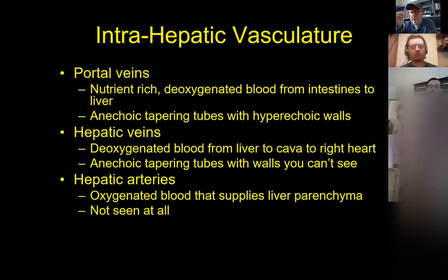Should I aspirate it anyway, just to make sure it's not a small mass inside the liver? Yeah, sure, go ahead. You're not going to hurt anything by aspirating it. How do you differentiate, once you aspirate it and put those cells on the slide? Do you have to send it out to see if it's fat or not? No, if it's fat, it never will dry. And if you stain it, it just washes away. So you can differentiate as soon as you blow it on a slide, you know it's fat.